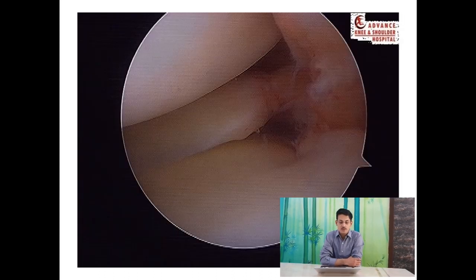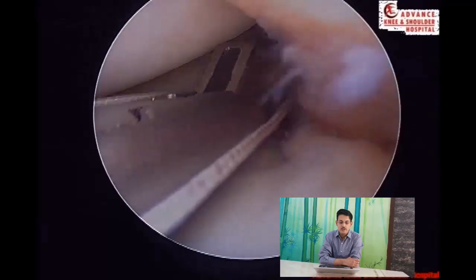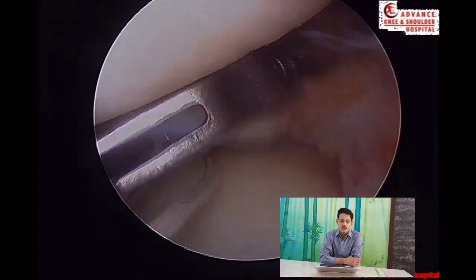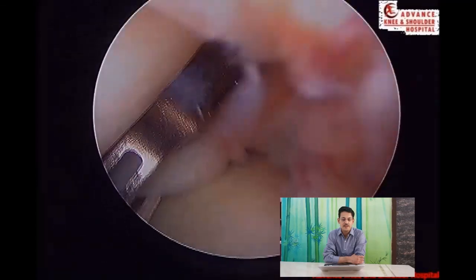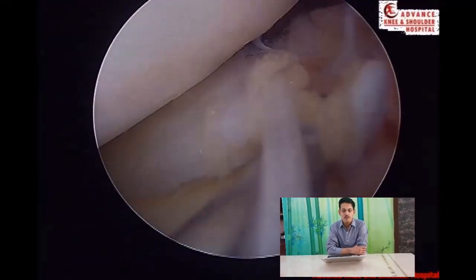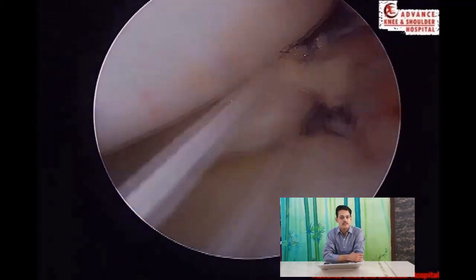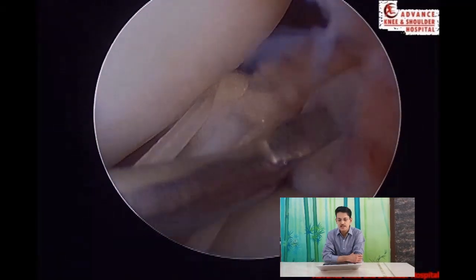This is a picture of a root tear seen arthroscopically. The procedure involves a little bit of pie-crusting to reach the posterior part of the knee. We use a suture self-passing and self-retrieving device — in this case a Mini First Pass; you can also use a Mini Scorpion or a Knee Scorpion. The sutures are passed sequentially and looped on themselves.